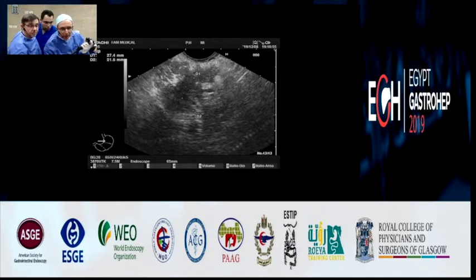This is abnormal, and we will need more examination. So, anyway, this irregular shape, the irregular border, these hyperechogenic strands here could be chronic pancreatitis, but they are not unequivocal signs of chronic pancreatitis. As you know, if we see just a few signs, we cannot rule out chronic pancreatitis.